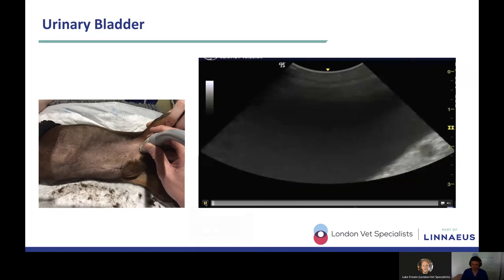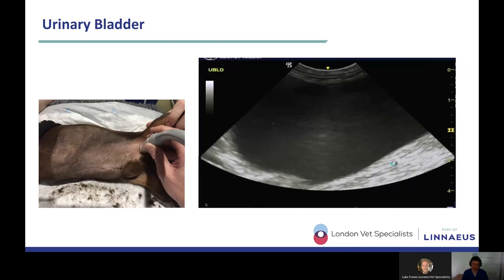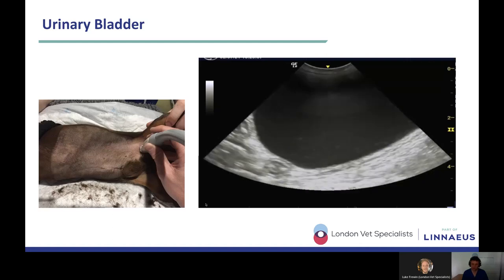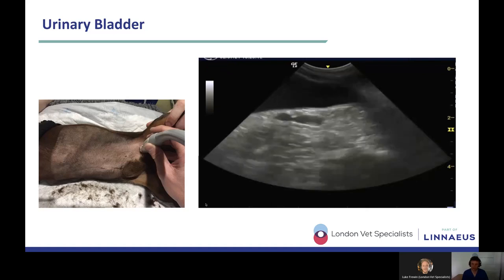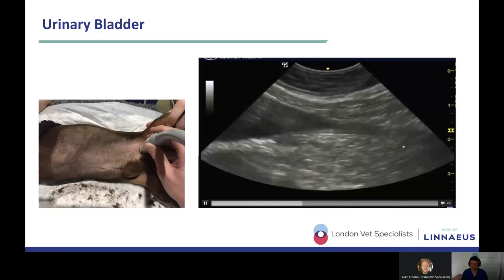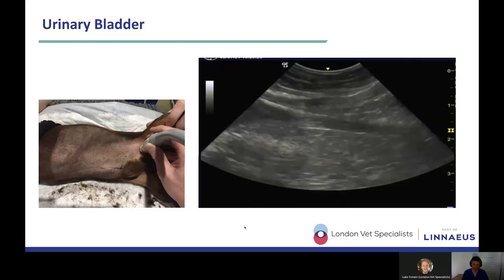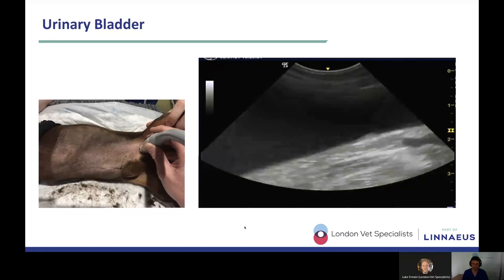So let's take another look at this video. That's me having popped the probe on the urinary bladder, on the mid part of the caudal abdomen. I'm doing a little bit of fanning dorsally and ventrally and sliding cranially beyond the apex of the urinary bladder. And I'm sliding caudally, and I've teased out the trigone, which we can see just here, and then part of the urethra. That's a predilection site for things like transitional cell carcinomas in the dog and the cat, but worth, again, developing that muscle memory, teasing out that trigone, looking at that urethra, that's nice and normal.